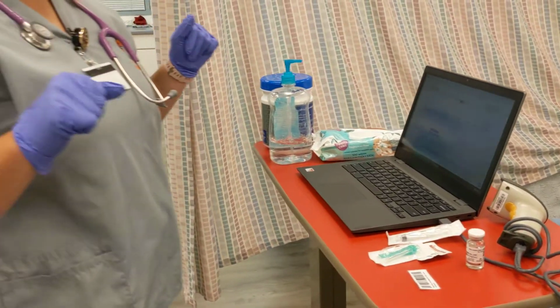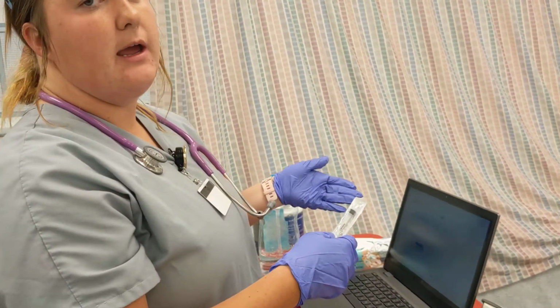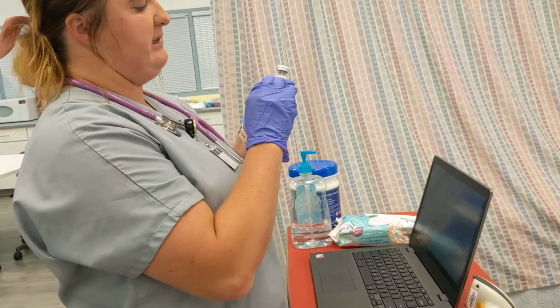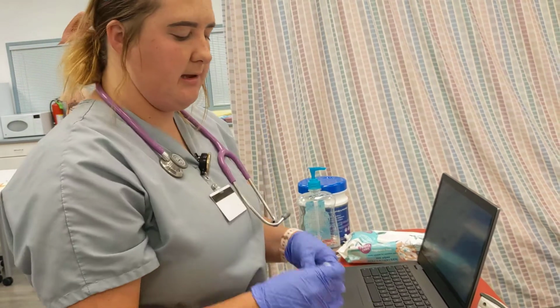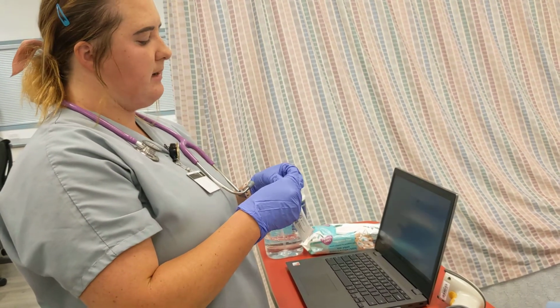Okay, so I did the math before we started this, before we came over here, and it wants us to draw up 30 milligrams. Our medication is 60 milligrams per 2 milliliters. And the math is that we're going to draw up 1 milliliter. So that's what we're going to do today.